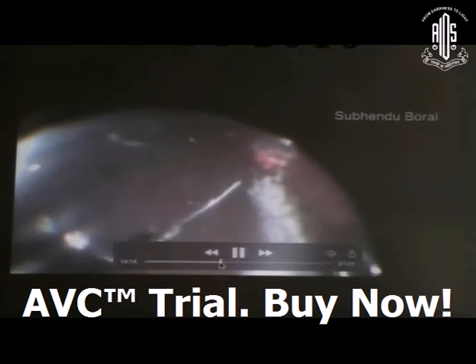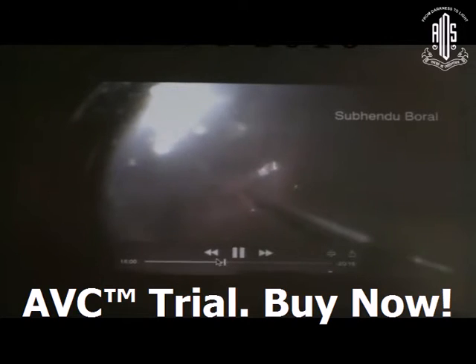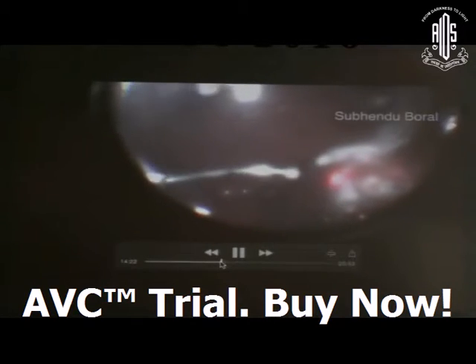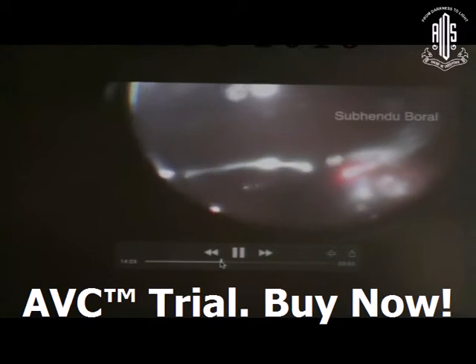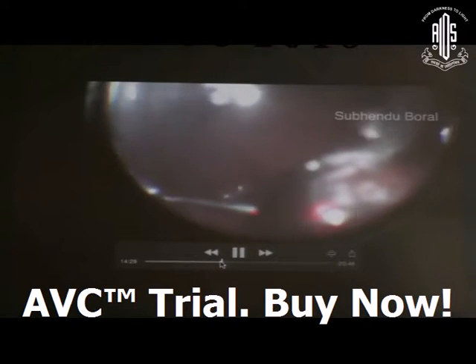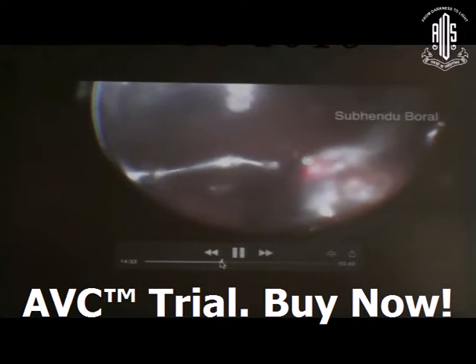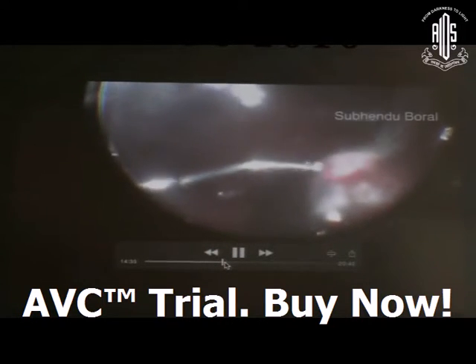Then do laser around the breaks as well as the ora area. Now, another very important part is the PFCL-to-silicone oil exchange. In these GRT cases, it is very important. Many techniques exist, but I follow this technique: inject silicone oil with the left hand while keeping the right-hand backflush needle inside the PFCL.